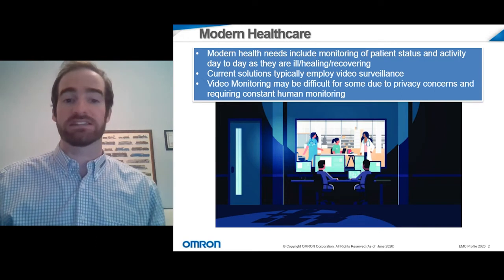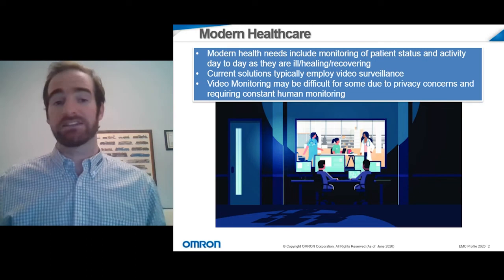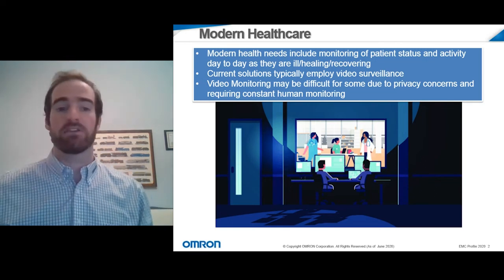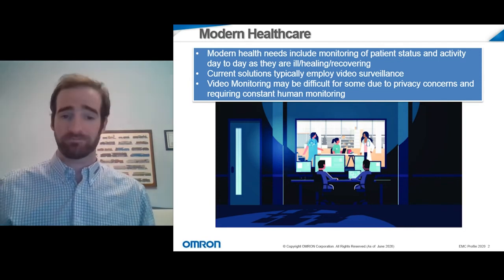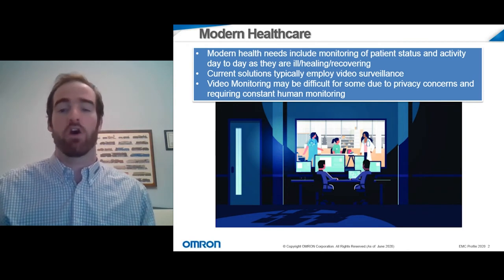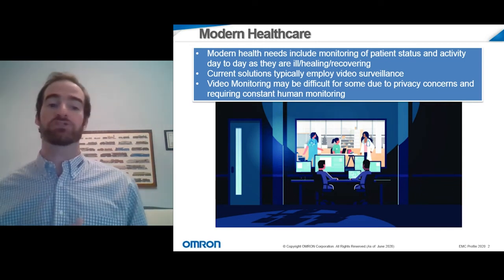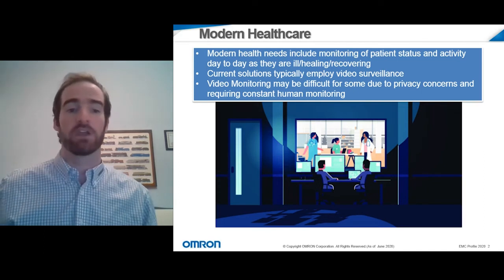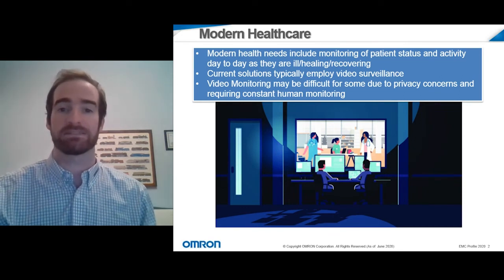Typical solutions for this type of need generally involve video monitoring, which is an effective enough solution, but it does, however, come with its setbacks. Just getting a video feed of a room will not give any sort of alerts as to the activity of the persons within the room. And any information that does need to be gathered on this, such as for fall detection or making sure that a person is staying active enough, really requires real-time human monitoring, people looking at those feeds in real time. We don't really have a way yet to automatically alert medical personnel when an incident takes place.